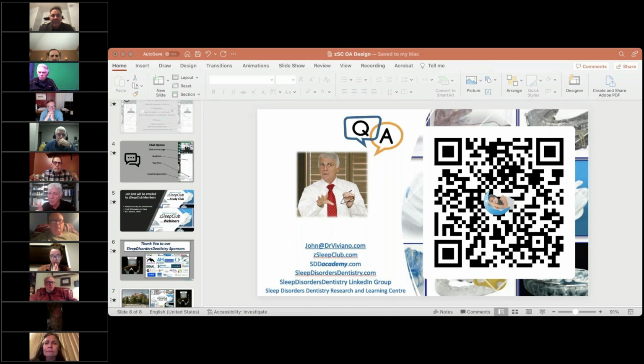When you're replacing the Thermocryl, you take all the Thermocryl out, which you just soften. Don't make it too soft because it gets gooey and then hard to remove. Just soften it slightly and it actually picks up in one piece. Now you go ahead and make a whole big shell and add it. It's really nice if you have a lower model. Now you adapt the model, and all you need to do is make sure the lower model is, I don't know, Kirk, is the model supposed to be wet or dry to keep it from sticking to it?